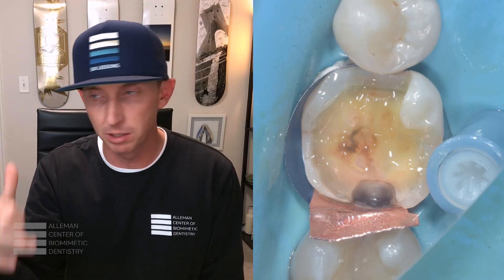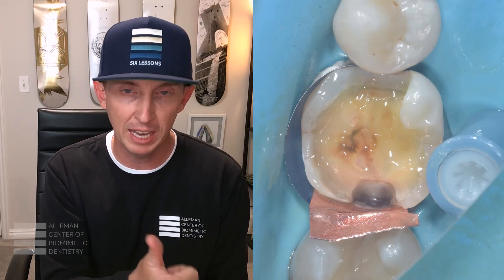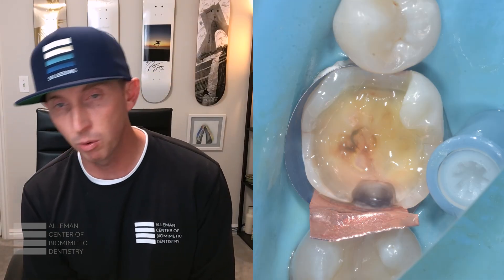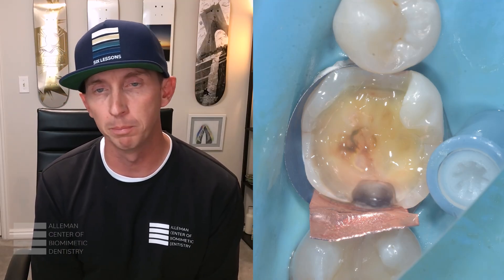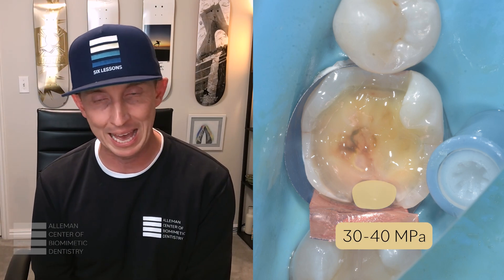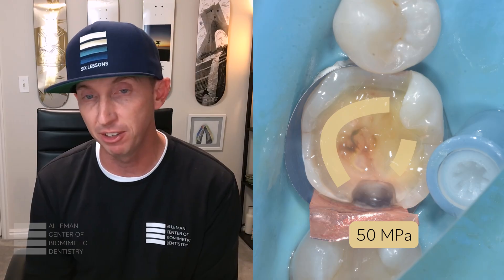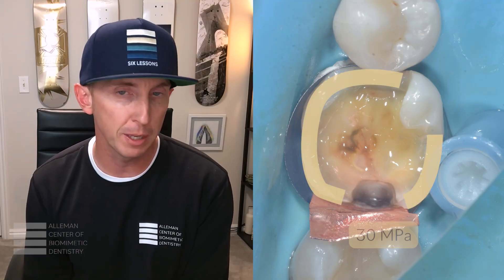When you do a deep margin elevation, banding it is the first battle. After you've done that, you're going to place an adhesive. This adhesive has a bond potential — you could be bonding to anywhere between three and upwards of six different substrates that have different levels of hydroxyapatite influencing composite movement. In this deep box where there's not a lot of decay, I'm thinking perhaps I'm getting 30 to 40 megapascals at maximum. On the superficial caries-free dentin, about 50 megapascals; the deep dentin on the pulpal floor, around 40 megapascals; and enamel, 30 megapascals.